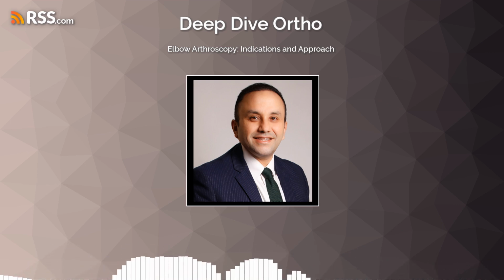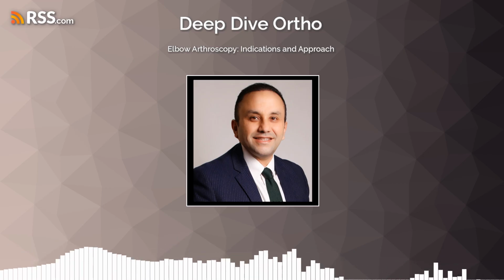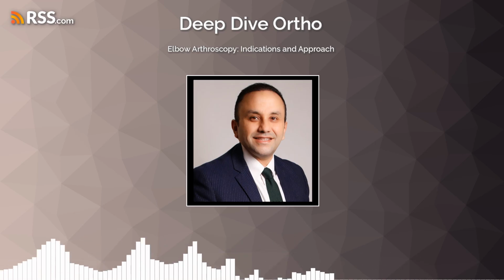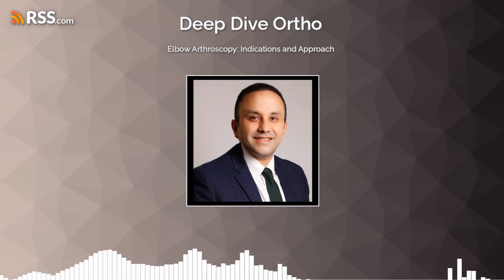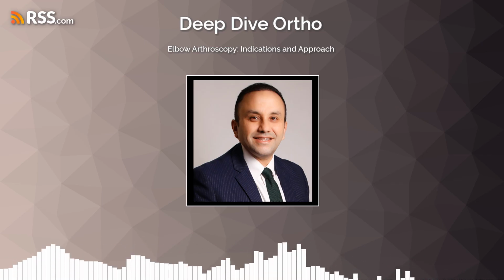Exactly. Arthroscopy is a very useful tool when physical exam is inconclusive for PLRI. During diagnostic arthroscopy, if we view the radiocapitellar joint from the anteromedial portal while supinating the forearm with the elbow flexed to 90 degrees, we will clearly see rotation and posterior subluxation of the radial head on the capitellum in patients with PLRI, unlike normal rotation without subluxation.